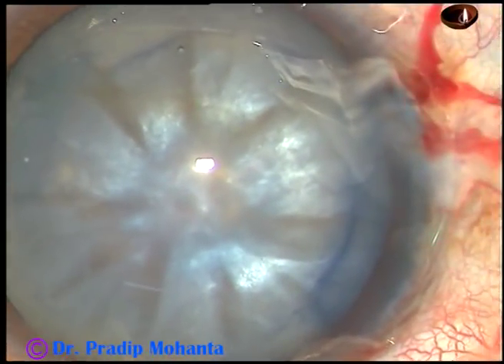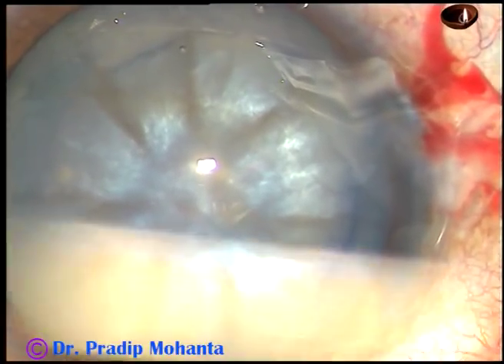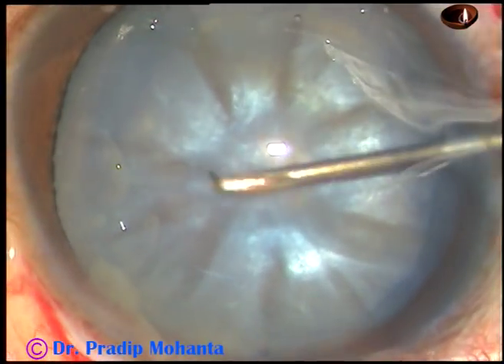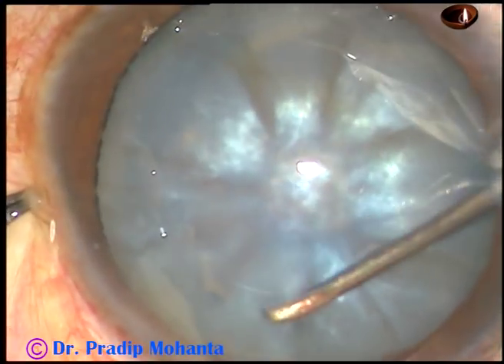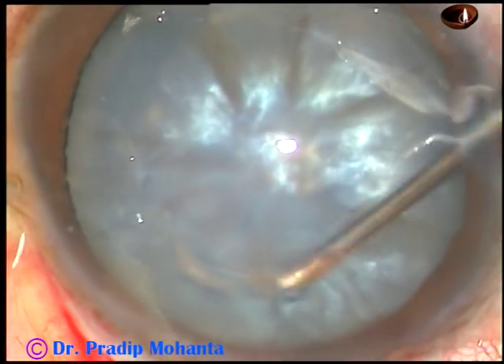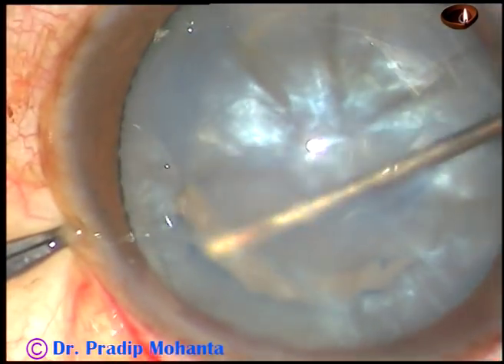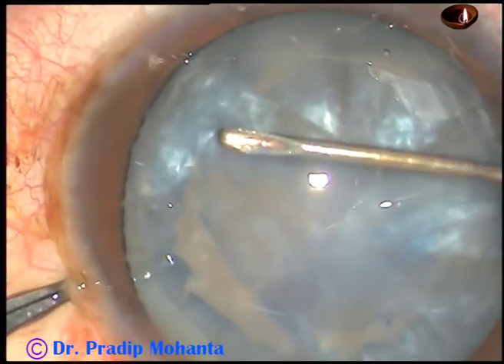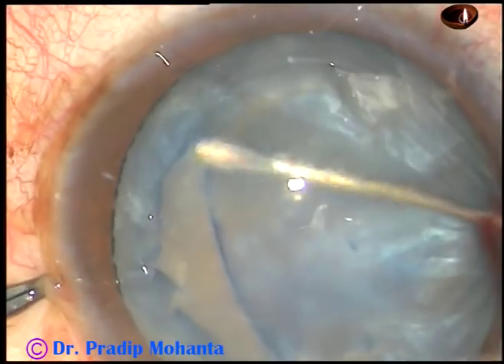Take a 26-gauge bent needle. In this case, since this is a mature intumescent cataract, the rhexis is not easy. Continuous curvilinear capsulorhexis is not easy. In ECCE, you can do a can opener capsulotomy by adjacent cuts like this.